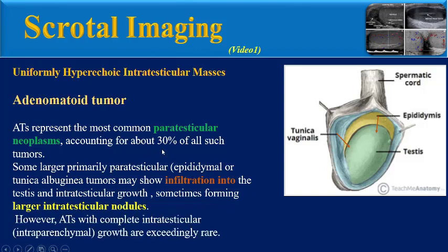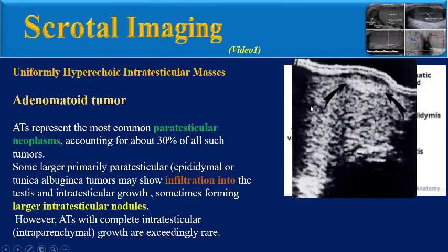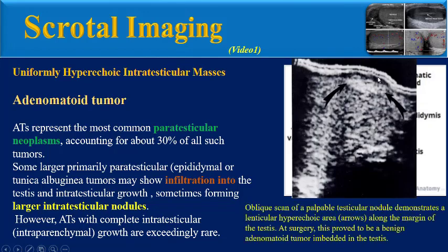However, adenomatoid tumors with complete intratesticular growth are exceedingly rare. This ultrasound image demonstrates a lenticular hyperechoic area along the margin of the testis, which at surgery proved to be a benign adenomatoid tumor embedded in the testis.